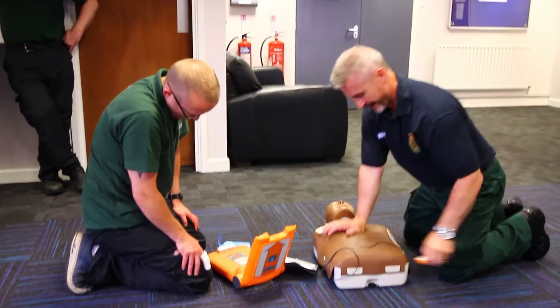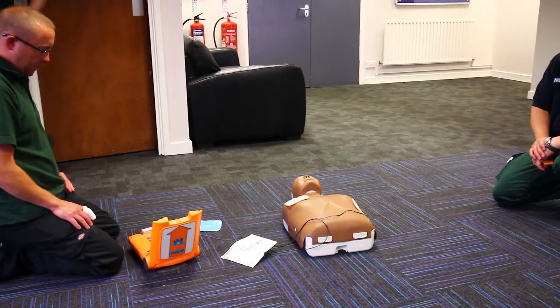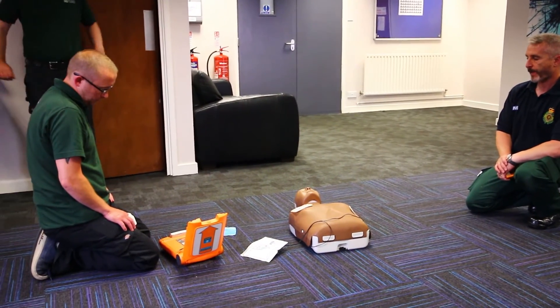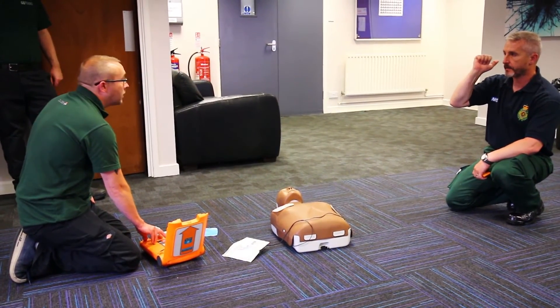Do not touch the patient. Back off. Analyzing heart rhythm. Shock advised. Do not touch the patient. No touch. Press red flashing button — pressing button, clear. Clear behind you. Clear behind me. Clear behind you.